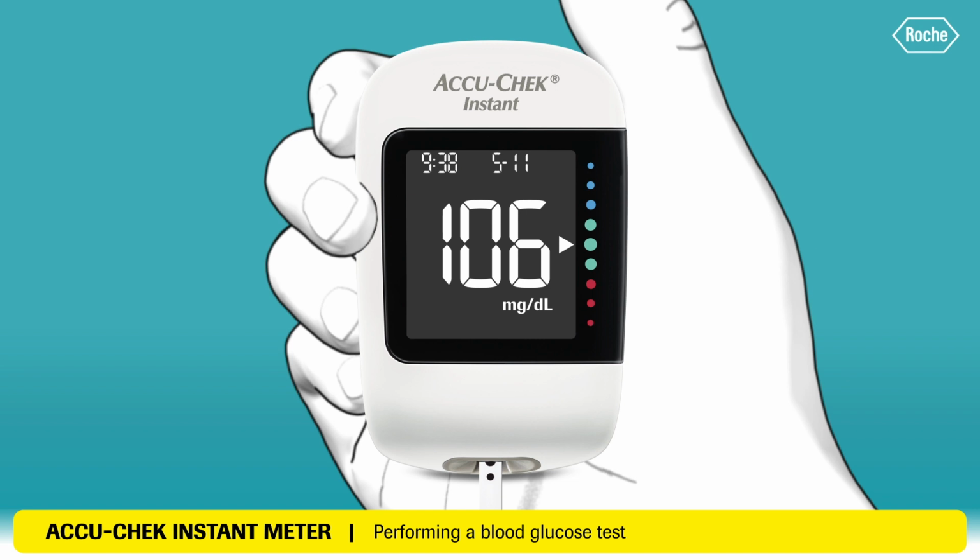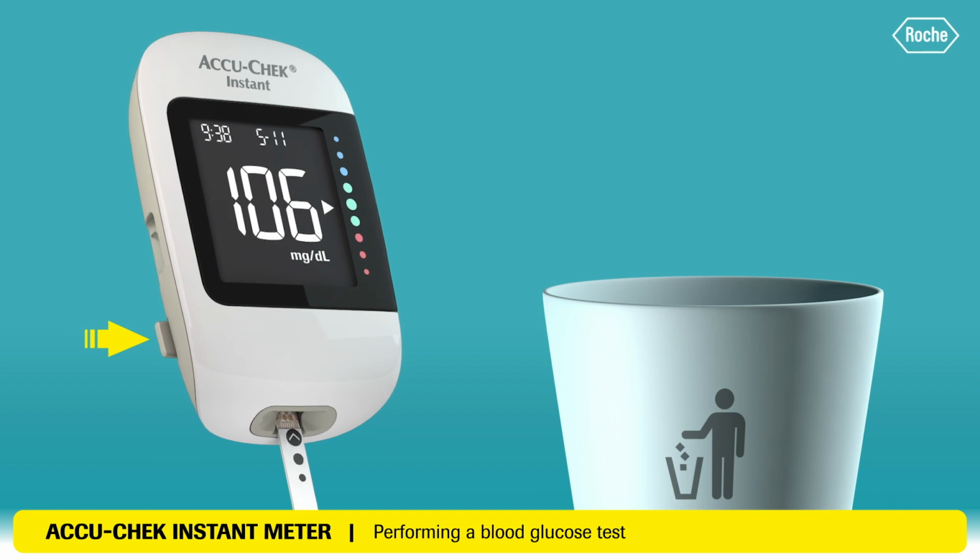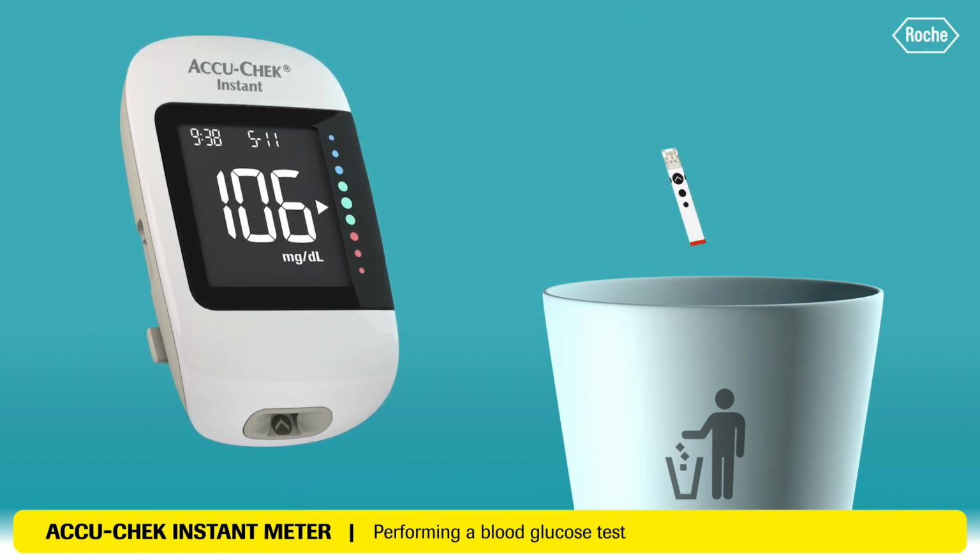When your test result appears, the arrow shows if your result falls above, within, or below the target range. The target range is represented by the green region of the target range indicator. One important final step: remove and dispose the used test strip.